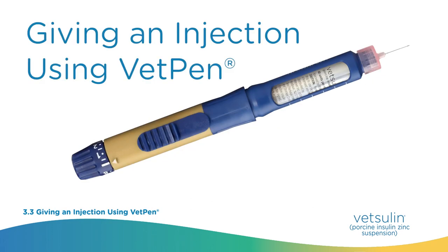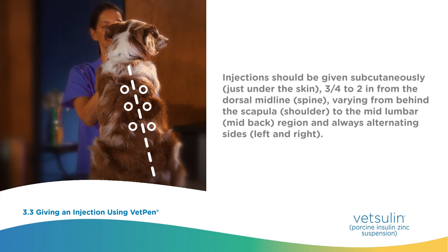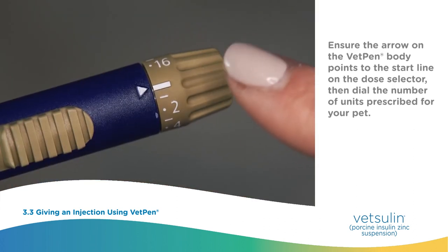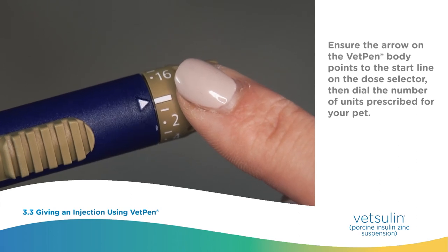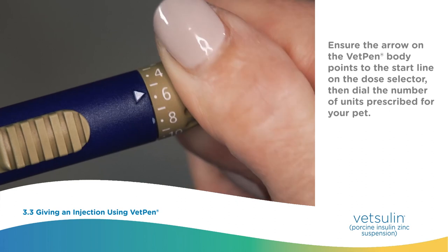Giving an injection using VetPen. Injections should be given subcutaneously, just under the skin, three quarters of an inch to two inches from the dorsal midline (spine), varying from behind the scapula (shoulder) to the mid-lumbar, mid-back region, and always alternating sides, left and right. Ensure the arrow on the VetPen body points to the start line on the dose selector, then dial the number of units prescribed for your pet.